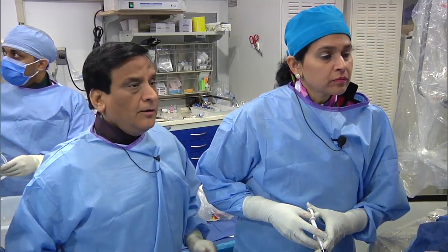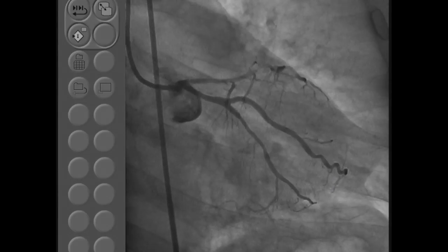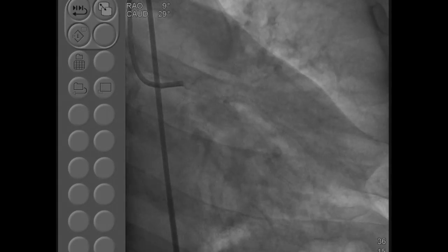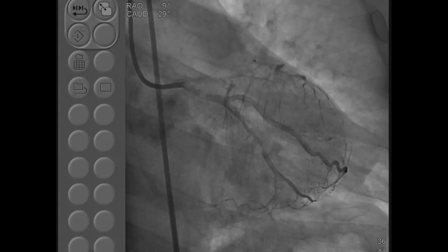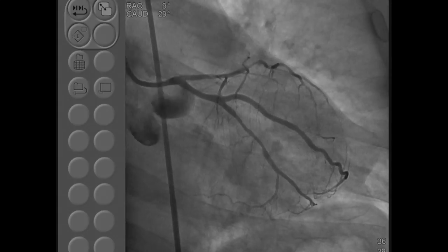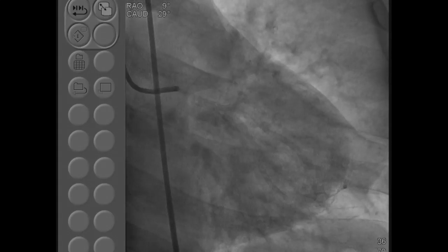And Anu has post-dilated that OM, and now we are taking a picture, and you can see here, looking fantastic. It's good now. All looking good. Any further comment? Anu, any final points from you?